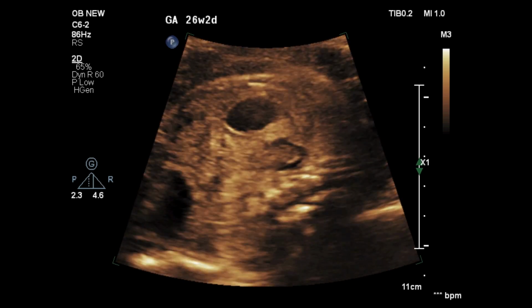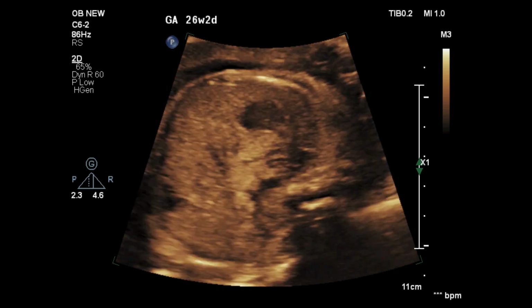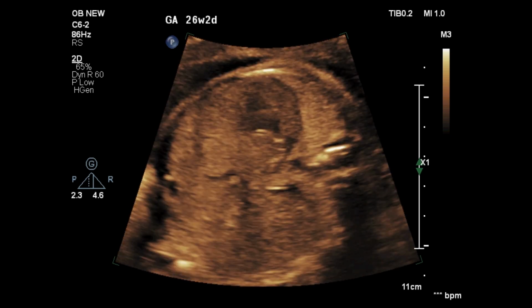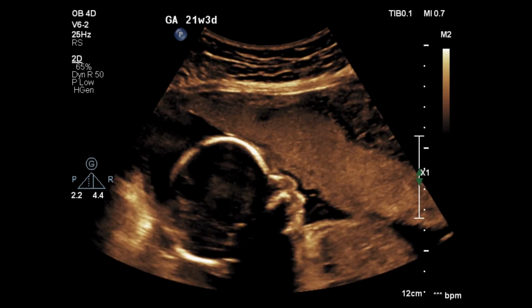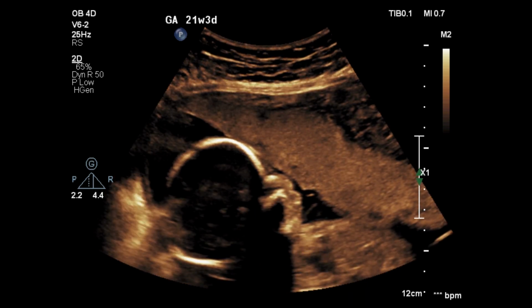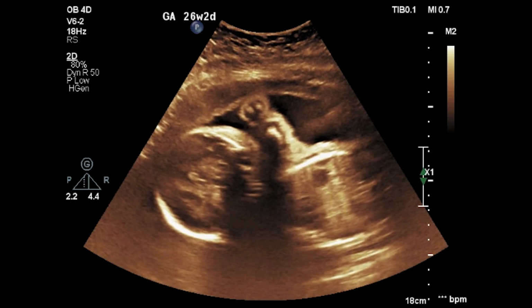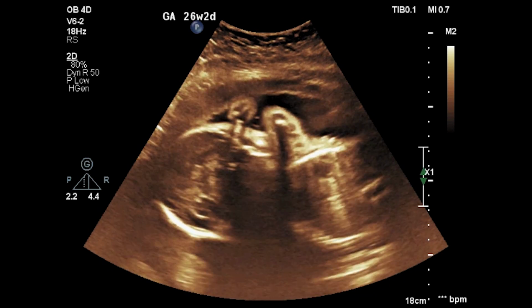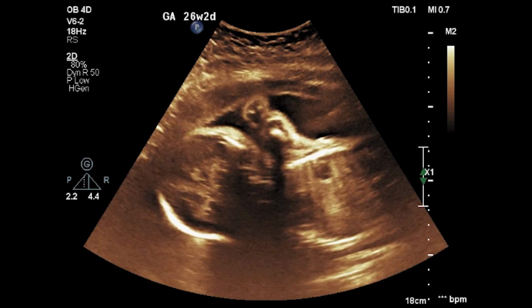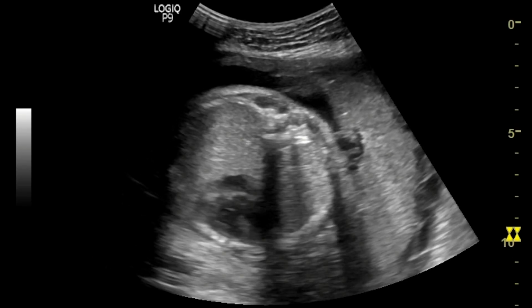I tried to take a view for abdominal circumference and the fetus started fighting. Here we can see a fetus jumping. Sleep is over, fetus is getting ready to get out of bed. Here respiratory as well as slight body movements are going on.